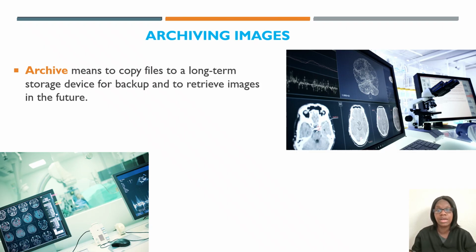So with archiving images, you all know, or hopefully you should know by now, that archive means to copy files to a long-term storage device for backup and to retrieve images in the future.